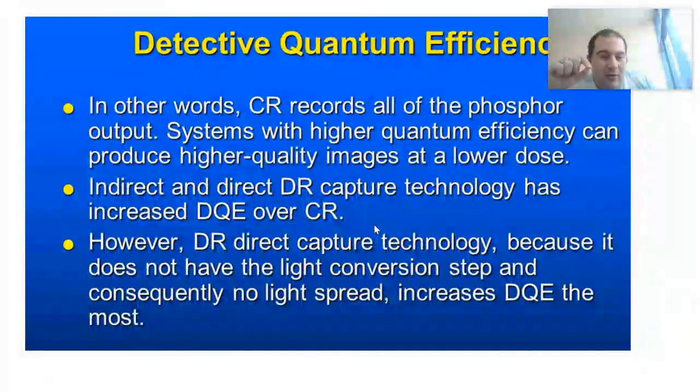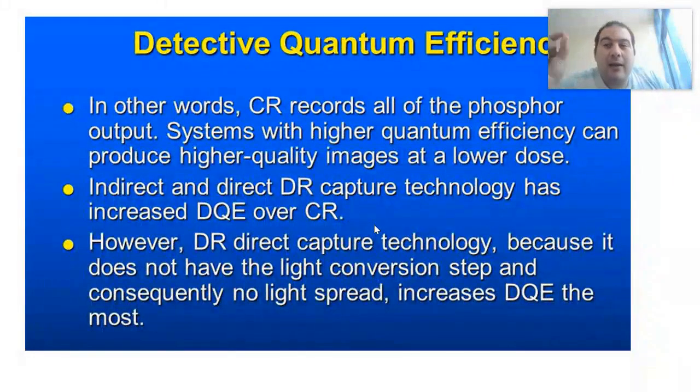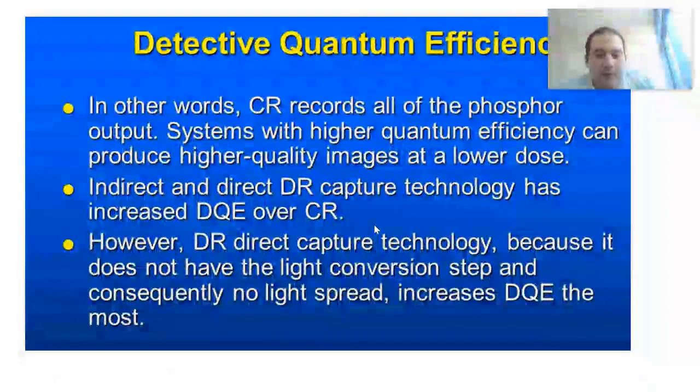When you look at the value of your SNR in the images, you find that when it increases beyond a certain value, the image becomes very smooth. If you increase the scan time or the imaging time, the image will give you a high SNR, but it won't provide high resolution. You will find that the SNR value decreases with small lesions and low doses. With the low parameters, you will notice this, and you will find it present with you.